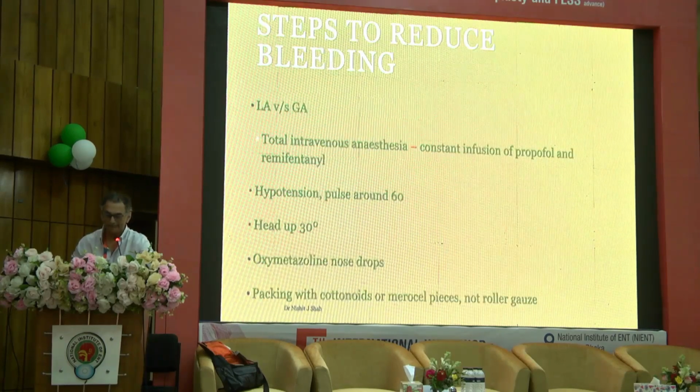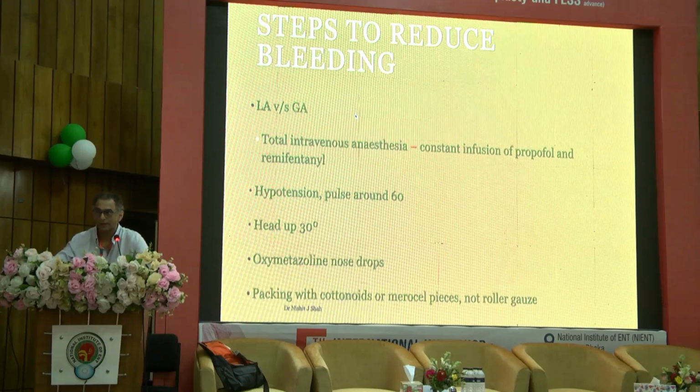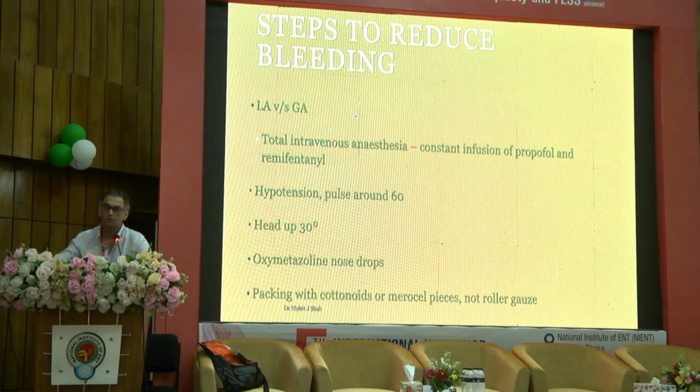Local versus GA, in the past we were doing a lot of surgery, and I'm talking of in the 80s, early 90s, that we were doing a lot of surgery under local anesthesia because of two things. We thought that there's a higher risk of bleeding under GA, and at that time most of our agents were inhalational, whereas in local it was definitely reduced bleeding. And two, the patient was our alarm bell. My eye is hurting, my head is hurting. So you know you're close to the eye, you know you're close to the brain. We were not that confident as surgeons.